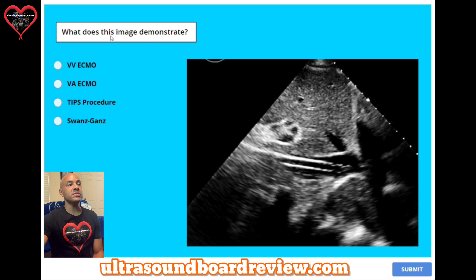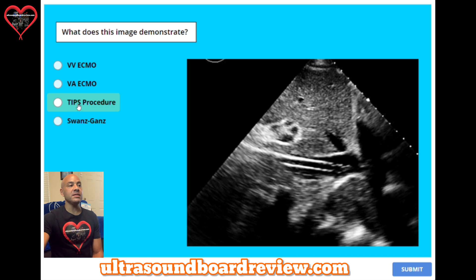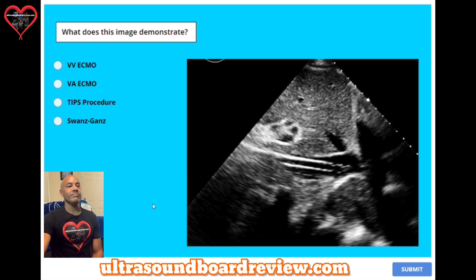Question 42. What does this image demonstrate? A: VV ECMO. B: VA ECMO. C: TIPS procedure. Or D: Swan-Ganz catheter. The answer is A: VV ECMO, and this is the cannula.